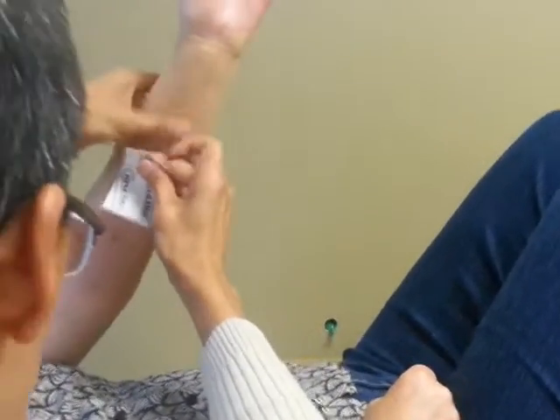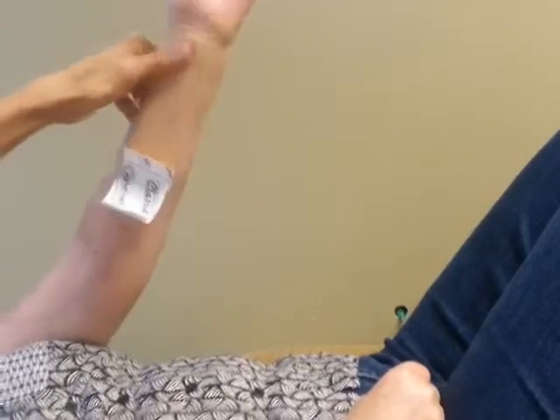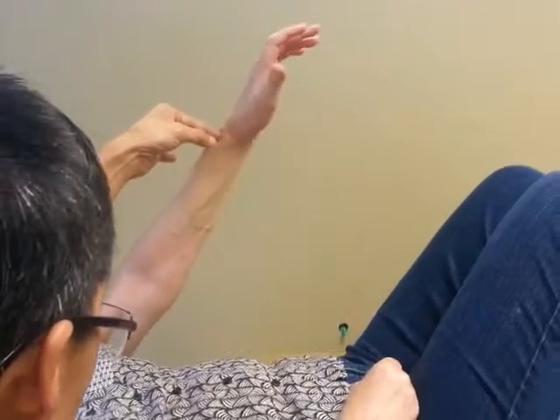Start rubbing. Now there's no stretch on the last part here. Then you go like this and basically let it down. Now you've got tape on that side. Then you do the same thing on this one — you start up here. Actually, I did this wrong. You have to start up here and go down. Why? Because the direction of flow is going to pull it from the direction that you start.